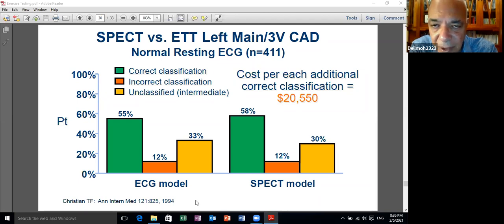واحد عنده symptoms، واحد intermediate grade of probability، ما عندوش manifestations من الليفت باندل والحاجات اللي هي كونترا انديكيشن اللي احنا قلناها، ويقدر يكسرسايز والاي سي جي بتاعه ريدبل. هم دول اللي احنا بندور عليهم. دول مش قليلين، دول اللارج ماجوريتي.